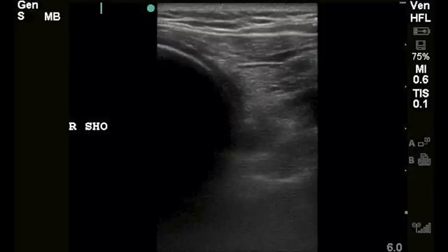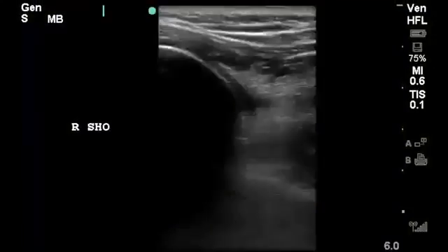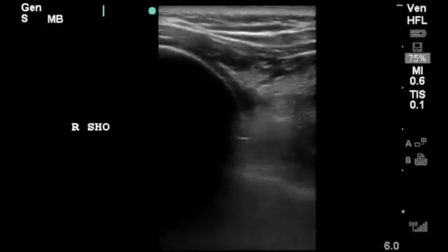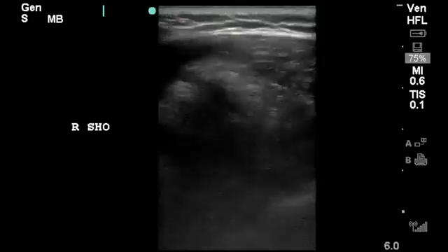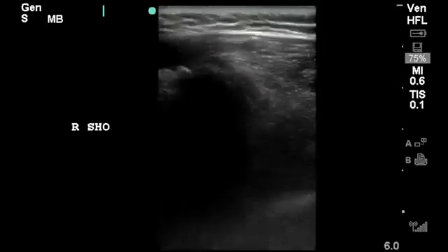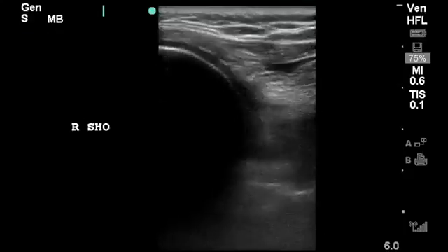In this still image, you can see immediately that something isn't right. The humeral head is way up here, and the edge of the glenoid is much deeper here. And remember, we are imaging posteriorly, so this is a posterior shoulder dislocation. So now in this clip, as we fan up and down from the humeral head, we see some hypoechoic and anechoic areas just superficial to the glenoid, which is likely blood.